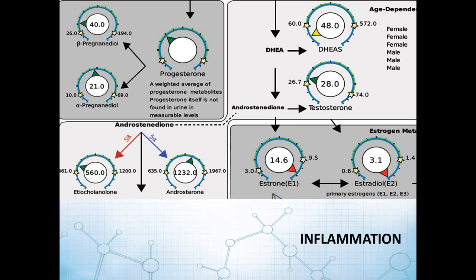Now, getting back to this gentleman's profile, it's actually a very interesting profile when you look at it in aggregate, in that his DHEAS is low. So this is an advantage of testing in urine with these broader panels. If you only looked at DHEAS in saliva, in serum, or in urine, you would conclude that this gentleman probably doesn't make much DHEA.